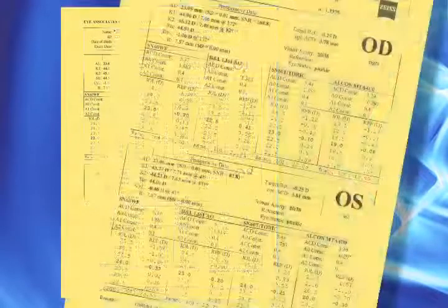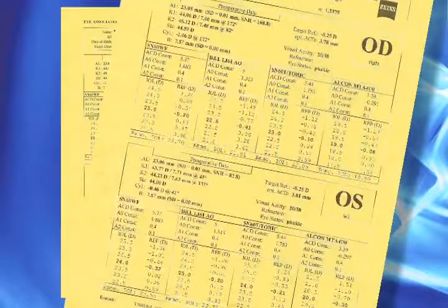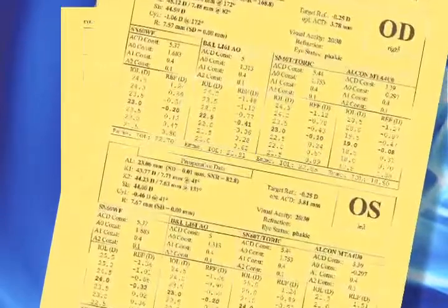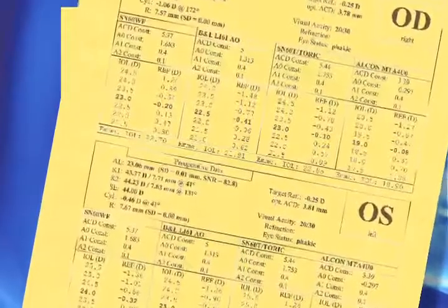However, there are two means of measuring the length of your eye. We like to perform both. That's because one is a check on the other, and they give us some different information between the two tests. The first of these, what you're looking at now, is something called an IOL master. This measures the length of your eye by optical means. All the numbers and the squiggles are helpful to me to determine just how accurate the particular test is.